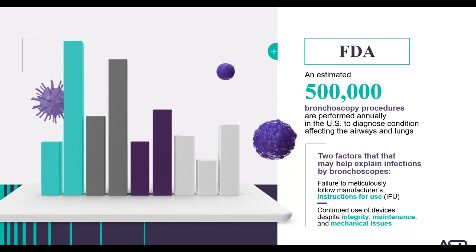In 2015, the FDA estimated 500,000 patients receiving bronchoscopes for diagnosis of conditions affecting the airways and lungs. And I suspect the number has gone up in 2020, especially with all the respiratory symptoms associated with COVID-19. The FDA also identified 2 factors that can contribute to infections associated with bronchoscopes. 1, not meticulously following manufacturer's instructions for use.